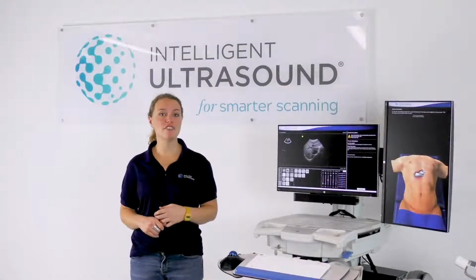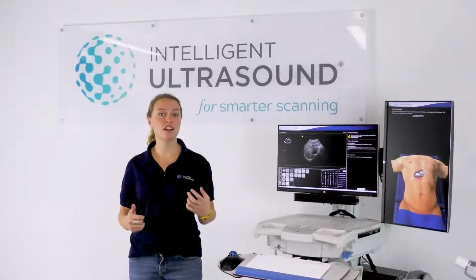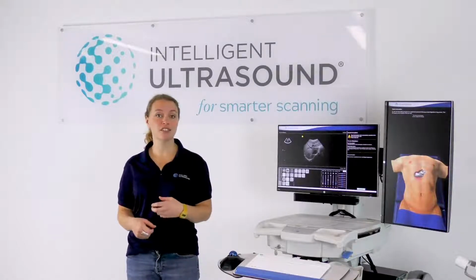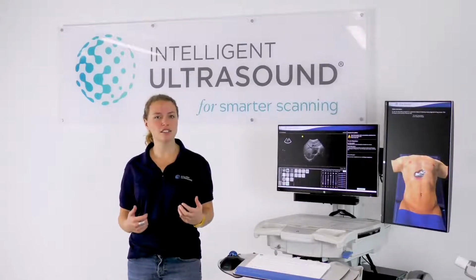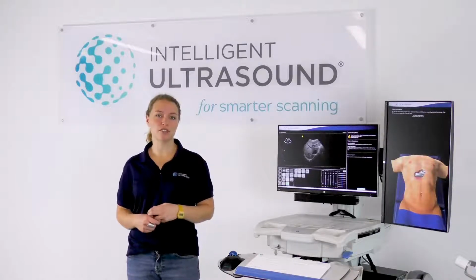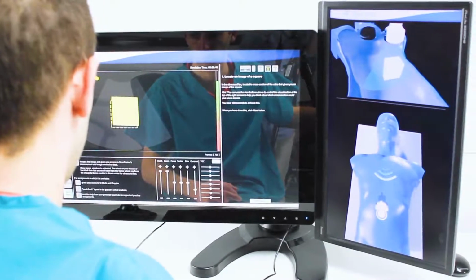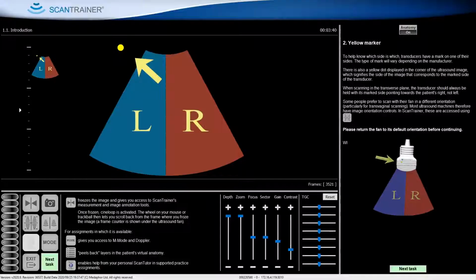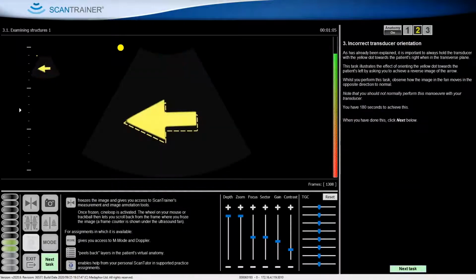There are modules for every level of learning, starting from the very basic ultrasound physics and probe manipulation, onto the core scanning skills in any of the specialisms, and then to the advanced skills such as spectral Doppler and obstetrics. Probe manipulation is an excellent place for learners to start and has been deemed a critical part of the learning pathway by instructors globally. It effectively builds fundamental understanding of how the 2D ultrasound images relate to the 3D anatomy, as well as how to move the transducer to acquire the images needed and to correctly examine complex 3D structures.